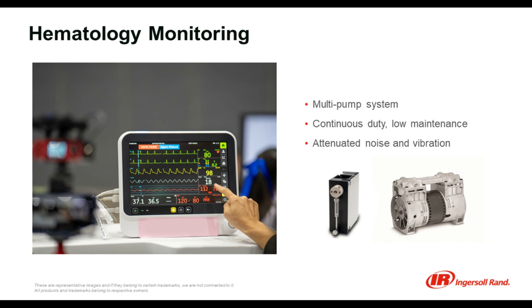So Tricontinent products are not going to be prone to vibration quite the same as the large die-casted products, as you see with the wobble pump on the right-hand side. So vibration was reduced by the configuration. It is an out-of-phase configuration, which means the forces are loaded equal and opposite to counteract one another.